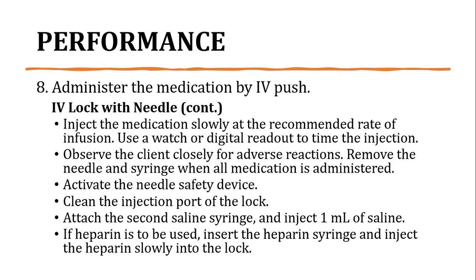administration kasi po yung heparin is usually nagkakaroon ng adverse reaction kapag sa client kapag nahalo sa medication. Usually halos lahat po or maraming kinds of medication na kapag nahalo sa heparin is nagkakaroon ng chemical reaction na nakaka-harm sa client. If heparin is to be used, insert the heparin syringe and inject the heparin slowly into the lock. Slowly po kasi yun nga po na directly siyang ina-administer sa blood vessel ng client.